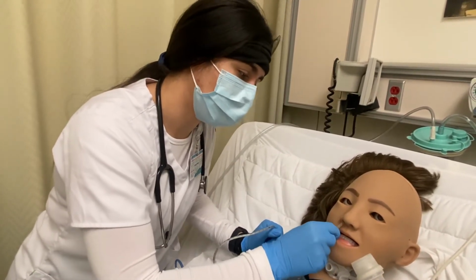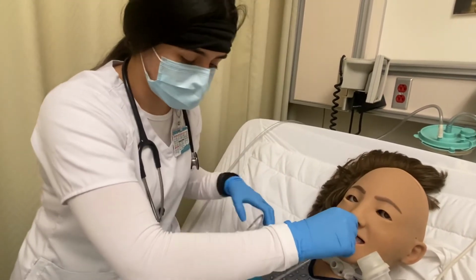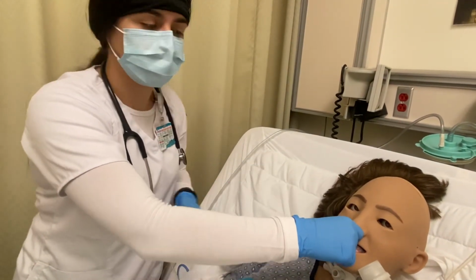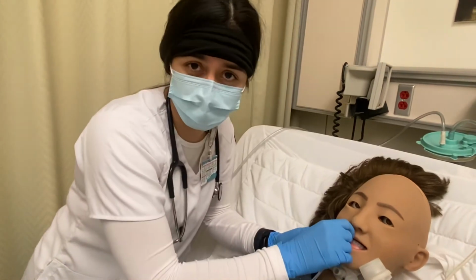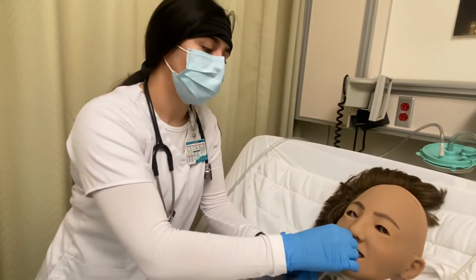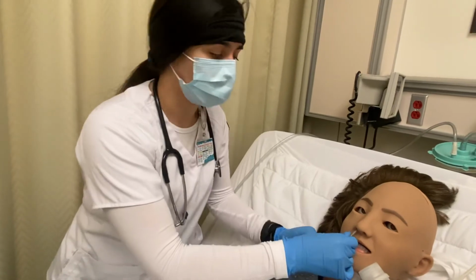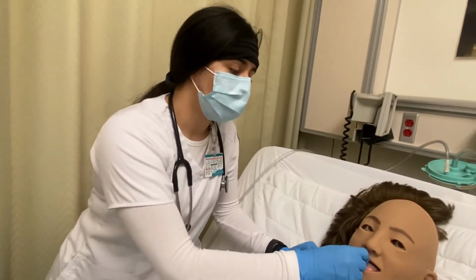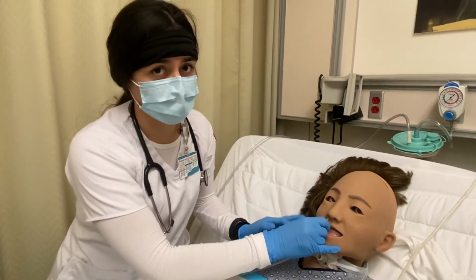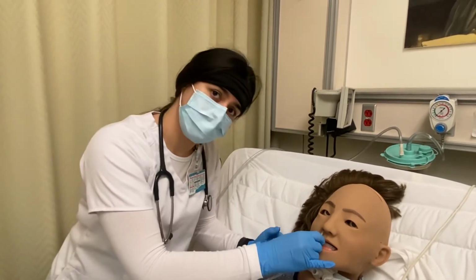So every time they swallow, go down, down, down until it hits the 50 mark where I measured it earlier. But with these mannequins, it's not going to let it go all the way down, and that's fine. After I feel it, make sure you're holding it, because if you don't hold it, it's going to come back out. And if the patient is coughing or gagging or choking, I would recoil it just a little bit, pull it back a little bit and then go back inside.